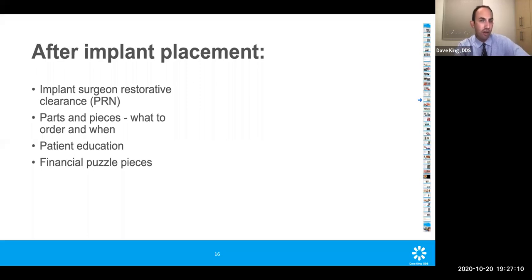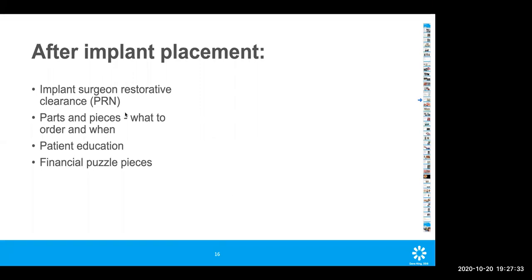So I'd be very cautious, just like with a cantilever bridge on natural teeth. The more cantilever force there is, the higher the risk of some untoward outcome. But yes, you can cantilever within reason, and I think if you have 2 implants, it's half the width of the inner implant distance you can cantilever. That's the generally accepted rule in my understanding. Great, thank you. You bet.